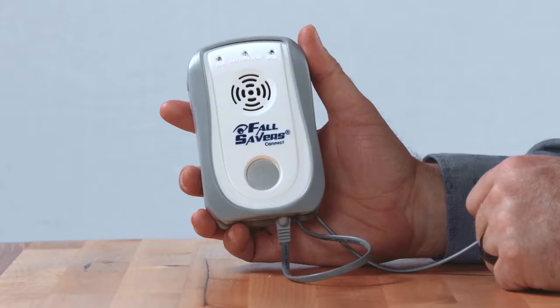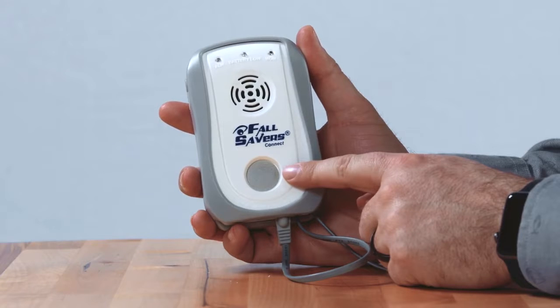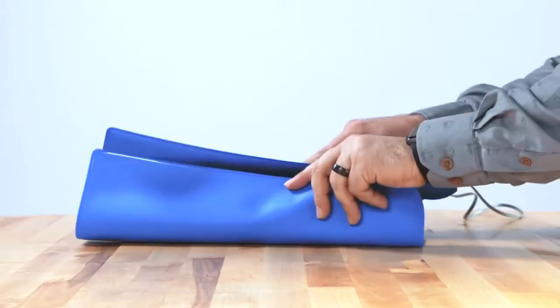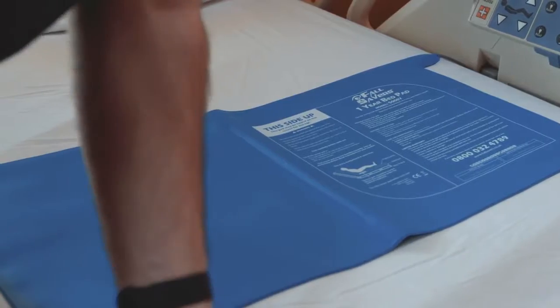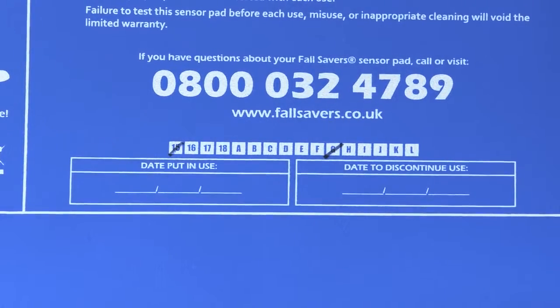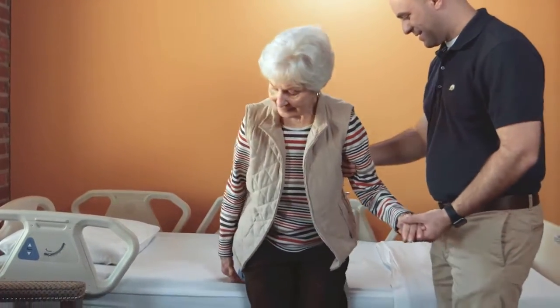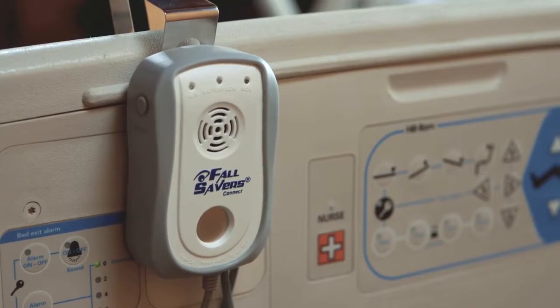A few reminders. The magnetic cord assembly should not be used if sensor pads are connected to the FallSavers Connect monitor. Chair and floor sensor pads should not be bent, rolled or folded. The FallSavers foldable bed sensor pad can be folded along the central crease line for easy storage. Note the date that the sensor pad is put in use so it can be replaced when its designated life has expired. Finally, the weight of a patient impacts pad operation. If patients weigh less than 80 pounds, 5.7 stone, alarms may not sound.